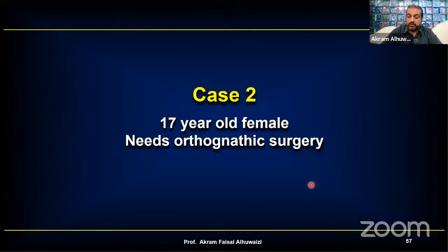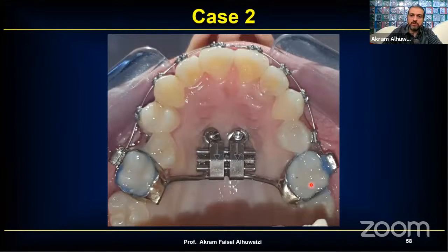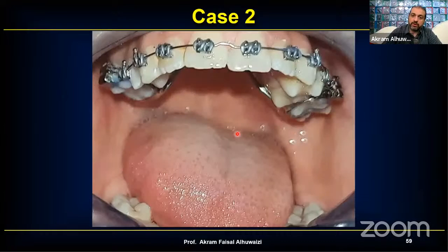So I go back home, and after studying all the weaknesses, I come up with a second idea. My next case, 17-year-old female, also needing orthognathic surgery. So I'm going to prepare her. And what I've done is use a hyrax. And this time I leave the posterior arms, and these posterior arms are our guiding arms, and just bend the anterior 2 arms and put some screws inside. They're also 2mm stainless steel screws, and I think they're 12 millimeters long. So that will ensure my bicortical perforation.